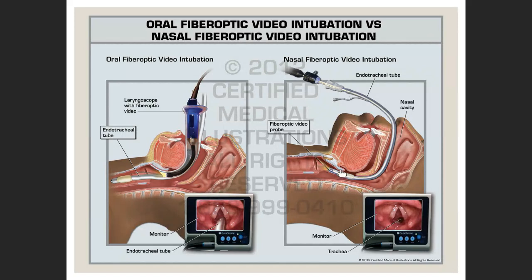Yeah? The epiglottis is anterior, and we're putting the tube just below it. Right? This is what the glottis looks like when you look through a laryngoscope. This is the epiglottis here. These are the cartilages of the larynx, the arytenoids, and those are the true vocal cords. And the space is the rima glottidis. All right? Everybody sees that? Everybody's happy?